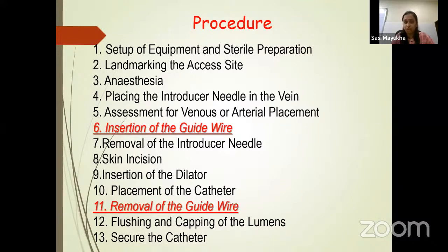If the patient is awake and conscious, we have to give local anesthesia at the site where we are going to insert the central line. After that, there are 2 ways you can do this procedure: one is landmark guided, one is ultrasound guided. The landmark guided procedures have been slowly moving out of date, and in the OT and ICU setups we have moved towards ultrasound guided procedures. In the next slides, I'll tell you how we do an ultrasound and how we identify the vein.